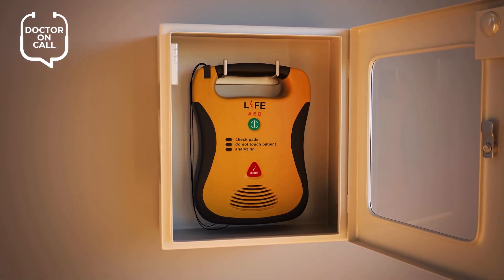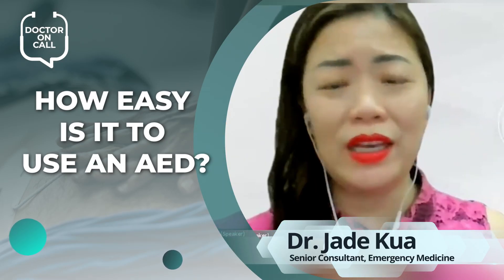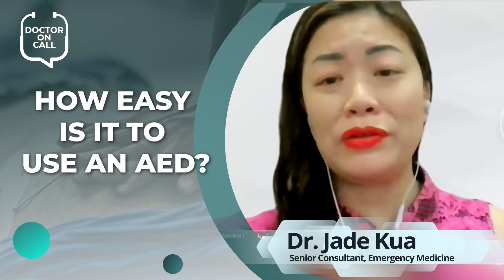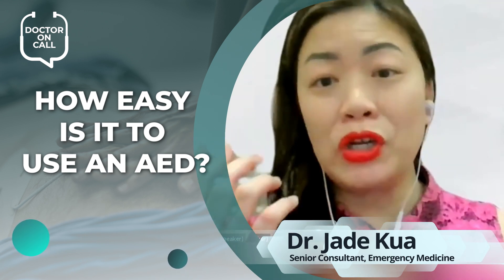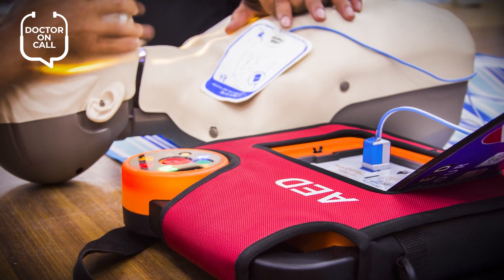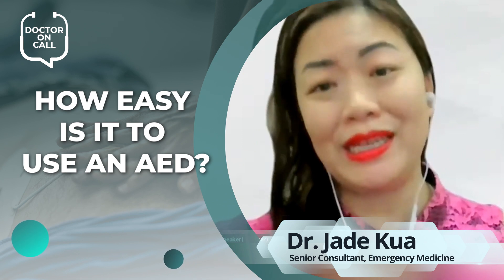It looks exactly like the button on your remote control for your air conditioning, your TV, everything else — so there's no way you won't know which one the on/off button is. When you switch it on, there's going to be an automatic audio voice that tells you what to do. If the pads haven't been stuck on, it will tell you to stick the pads on.